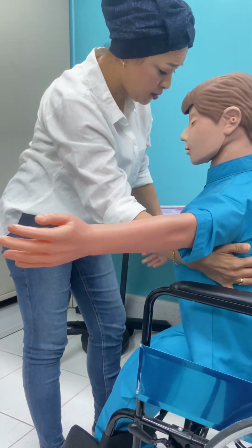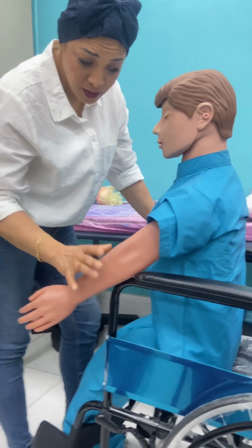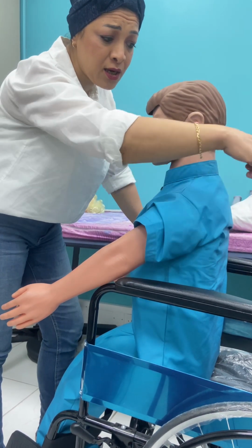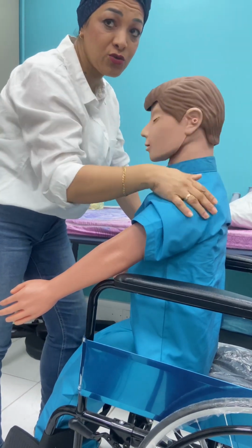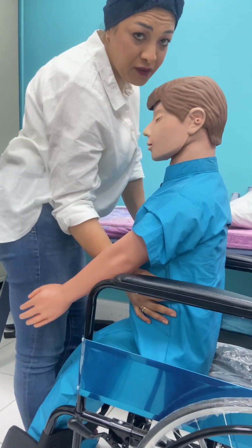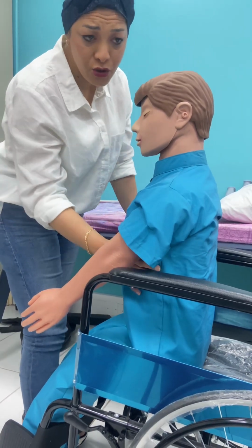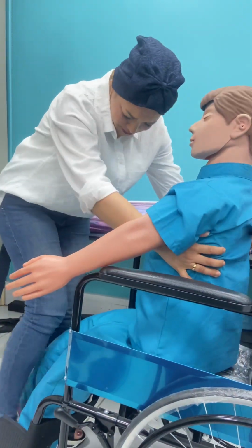His arms should be here, but as you can see, he's still at the edge of the chair. This is unsafe. I don't leave the patient by myself. Some PTTs use a towel or bed sheet, they put it on the chair, okay? So they can come from behind and pull the bed sheet, it will pull the patient with it. Otherwise, I ask the patient to cooperate, if he can just go back, left and right by himself, that's very good because you ask the patient to move his muscles and his body. Otherwise, you help him, so you hold him and you take him back. He's not flexible.